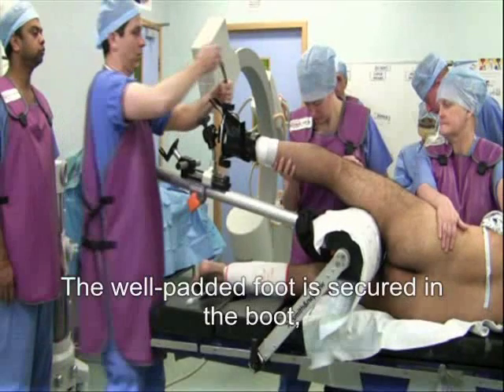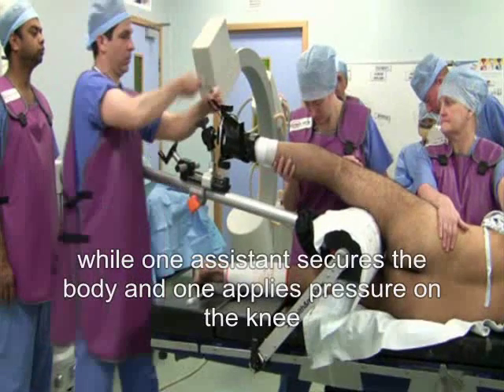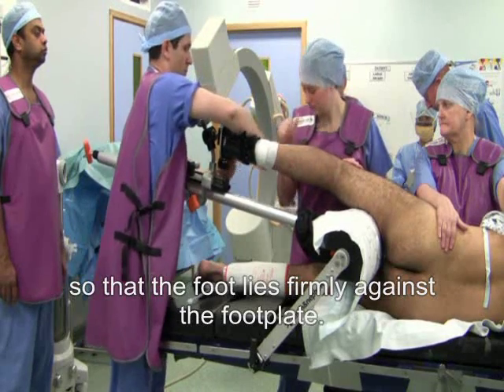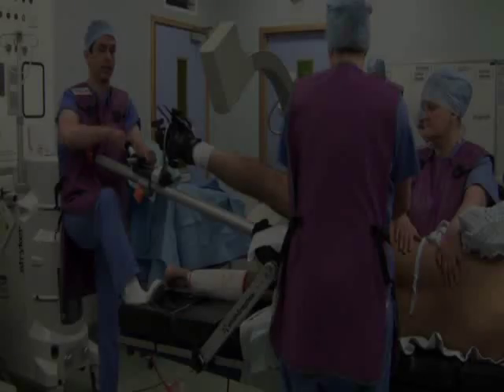The well-padded foot is secured in the boot while one assistant secures the body and one applies pressure on the knee so that the foot lies firmly against the foot plate.